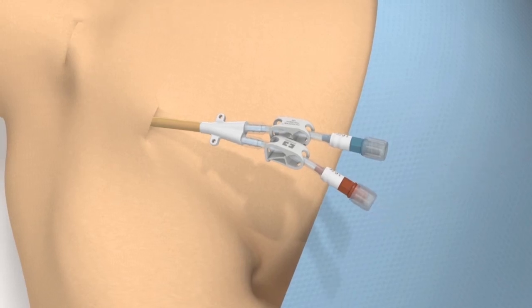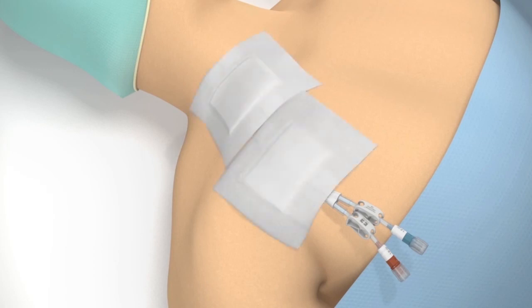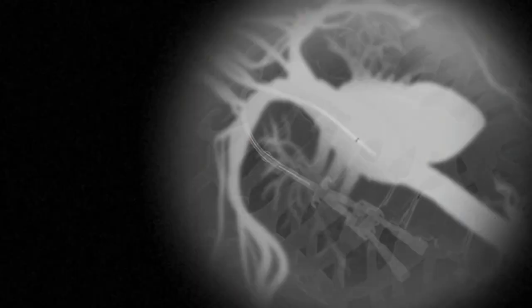Suture the entry site and stabilize the catheter with sutures using the extension wings on the catheter hub or by applying a catheter securement device. Apply a dressing to the catheter insertion and exit sites. Confirm final catheter placement with fluoroscopy.